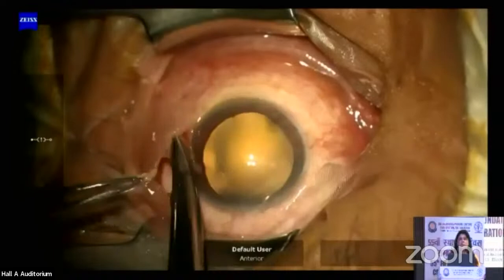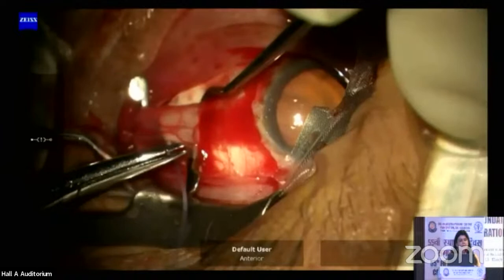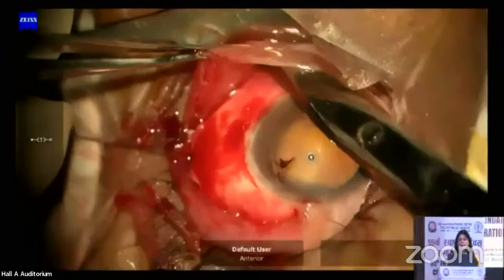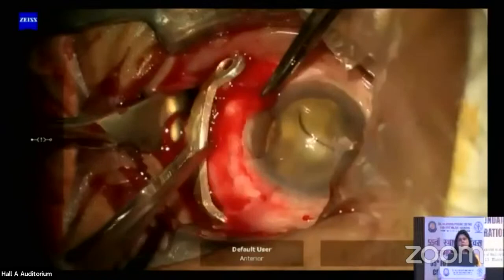The patient and the eye are nicely anesthetized, so we do a peritomy. And if you remember, we are operating the left eye and the mass is located temporally. So we have the lateral rectus where we are putting these sutures. Many times it depends on the location of the tumor. In this case, we have to disinsert the lateral rectus so that we can access the portion of the sclera that is immediately above the tumor. We don't have to do this step in every case. This depends on the location. Sometimes the tumor is located in such a quadrant where we can do it between the two muscles. But in any case, we did that here.